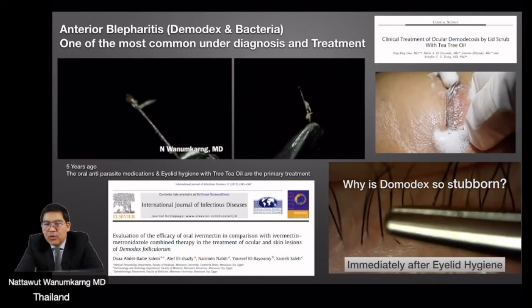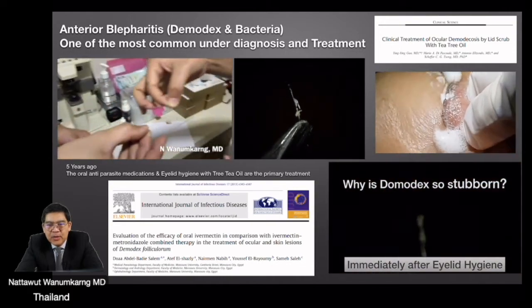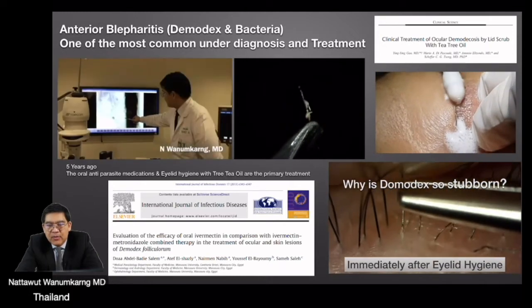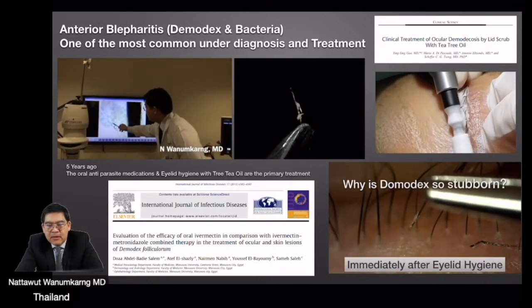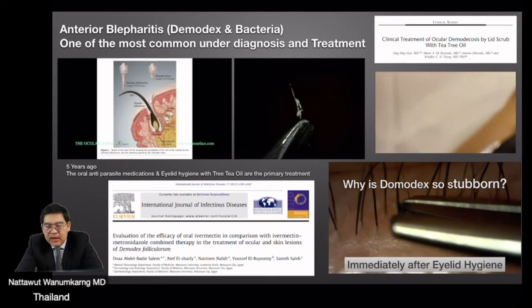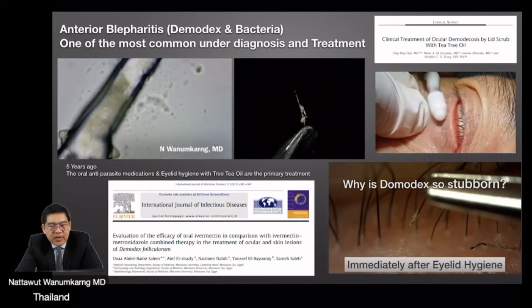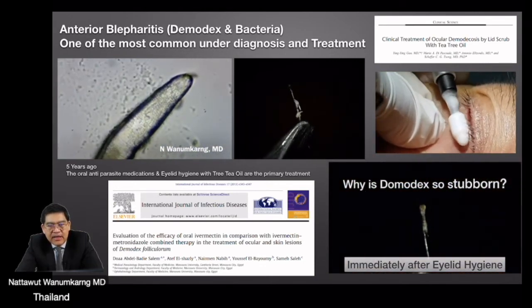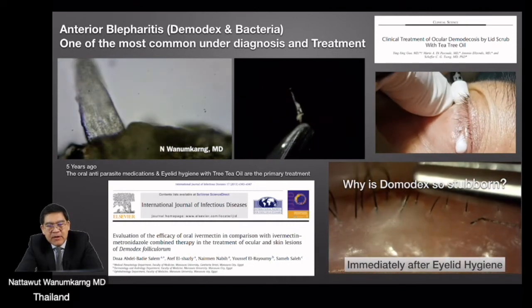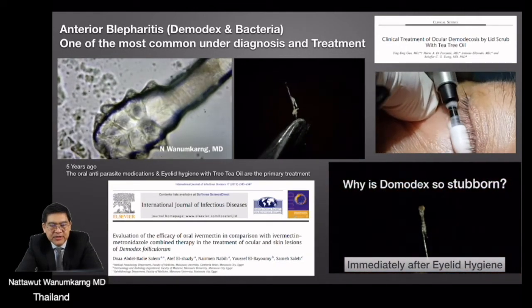5 to 10 years ago, the treatment started with eyelid hygiene with tea tree oil. Even with the machine called BlephEx, we found that the Demodex is so stubborn. In the video on the right lower, immediately after the eyelid hygiene, we could still see the body of the Demodex lying underneath the skin in the hair follicle. Even though we tried anti-parasitic treatment and eyelid hygiene with tea tree oil, the study showed that the eradication remission rate of Demodex is only 71.6%.